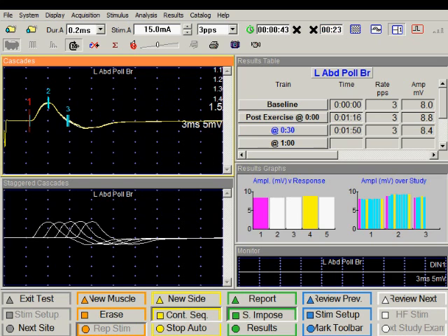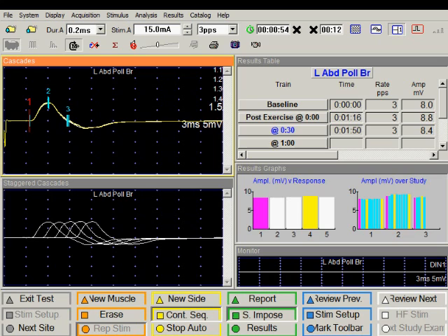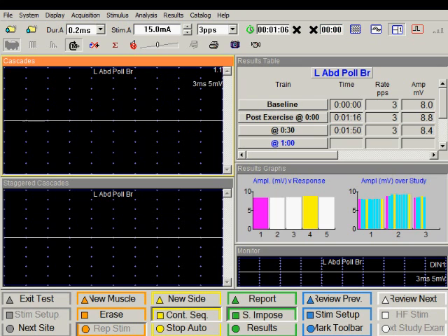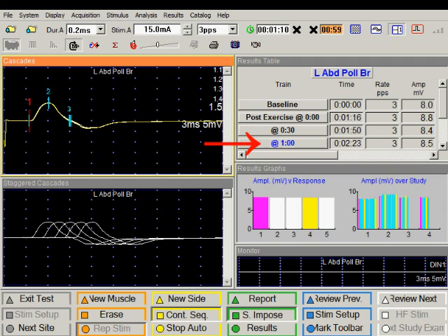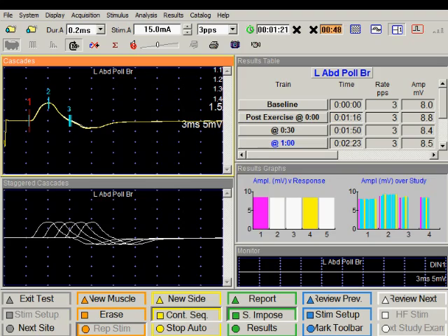It's going to count down for another 30 seconds, so that will be a total of one minute after exercise. The system will stimulate automatically. As before, we will get a warning at five seconds, and the process will continue as programmed in the system. Automation makes it very easy and comfortable to perform repetitive nerve stimulation post-exercise.